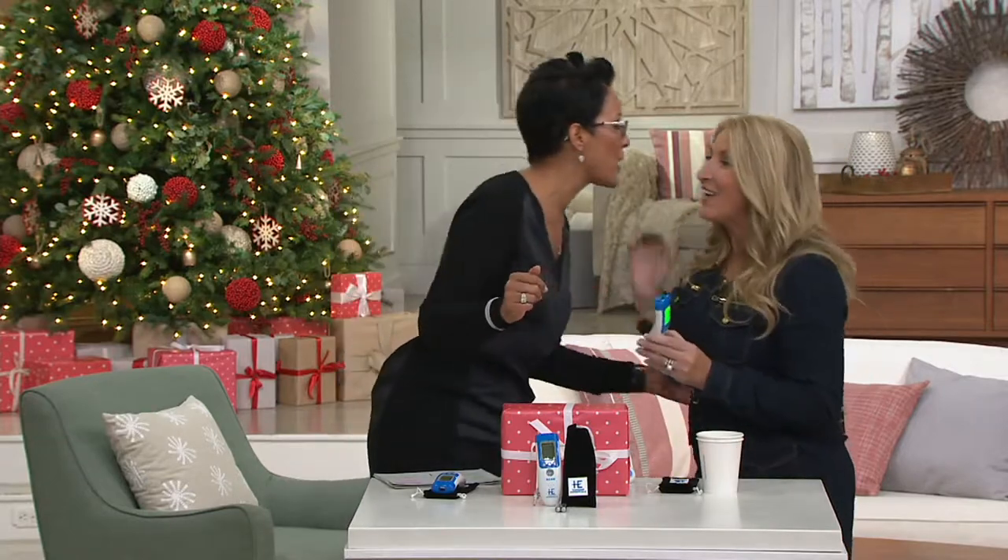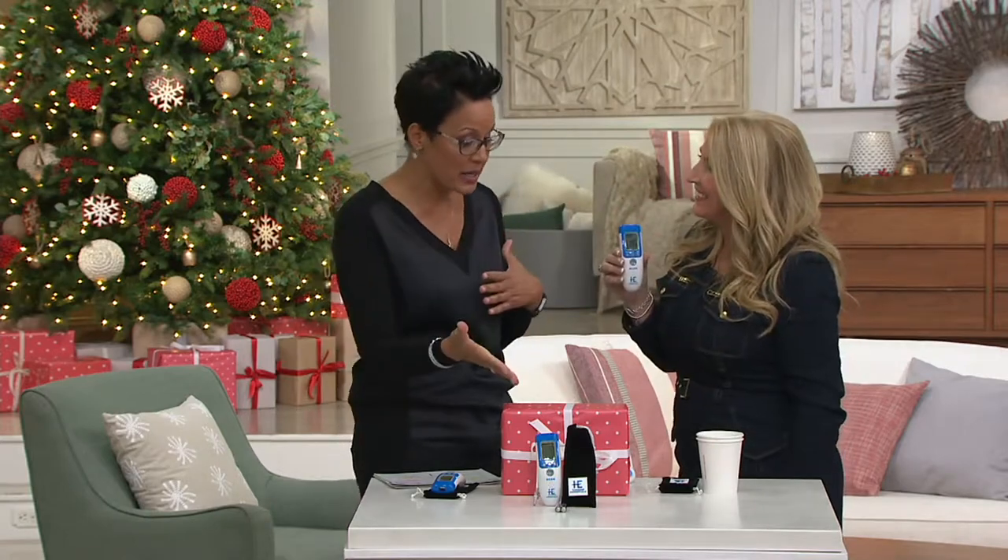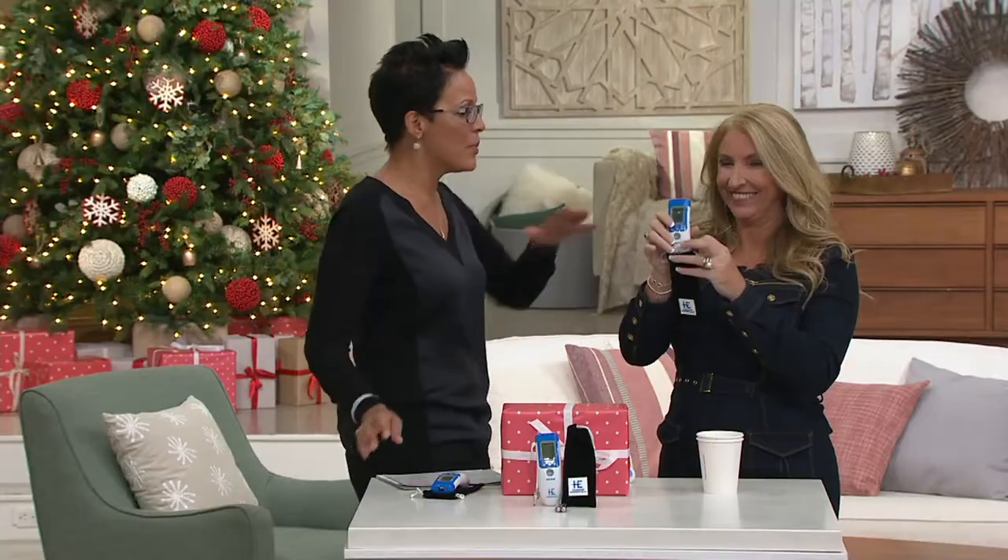And Janine Mullen, thank you for writing this to us — I really appreciate it. You're getting exactly what you need: you get the thermometer, you get a carry bag, and you also get the batteries too. So it's ready to go the minute you get it. I'm insane for this. And it sounds funny because you're like, it's a practical gift. Why do you like it so much?